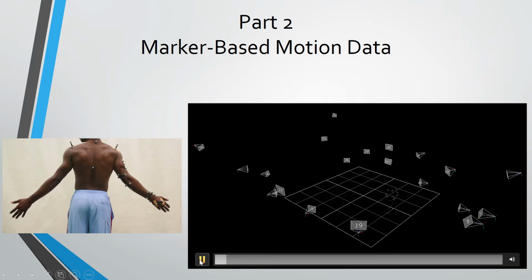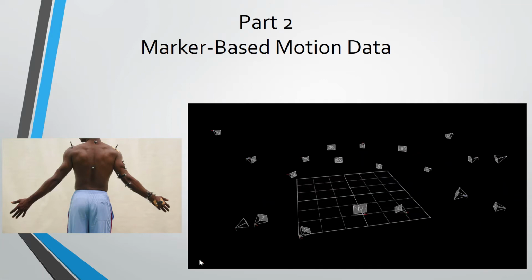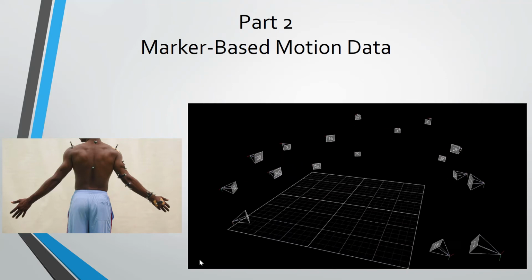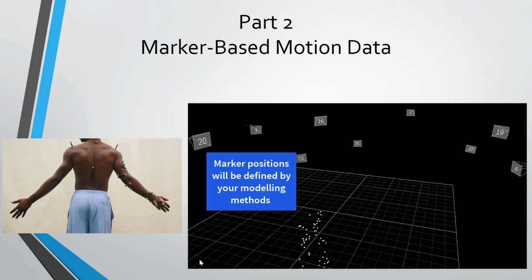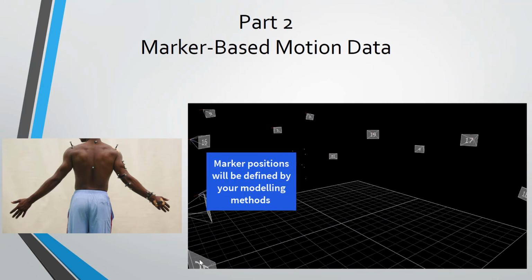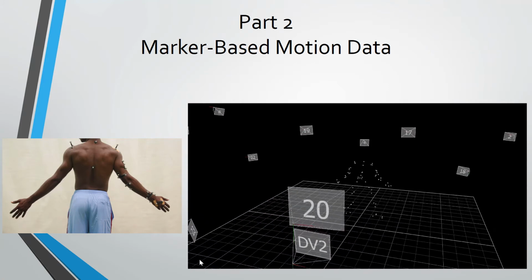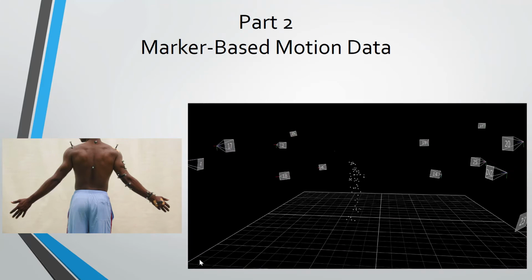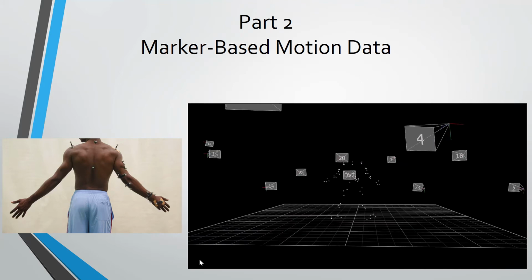First step, each marker has been positioned for a specific reason. Whether this has some anatomical relevance, for example on a bony landmark, or if it is just placed on a particular segment, and this is generally what our triads are for. We just arbitrarily place the triads on the segments for certain models. So the first step we perform with our marker data is we allocate a name and label to each of them.